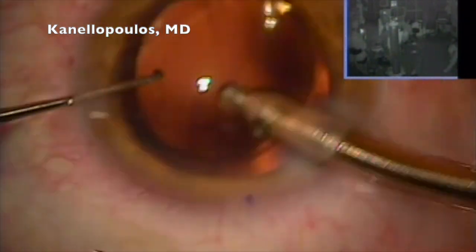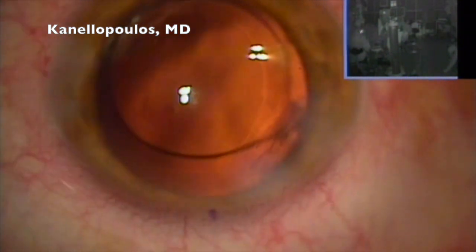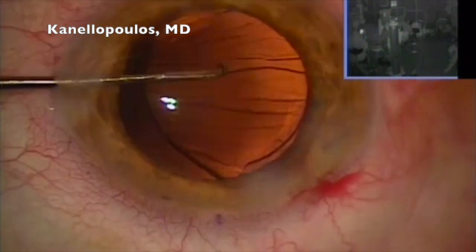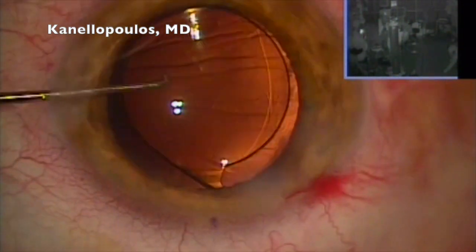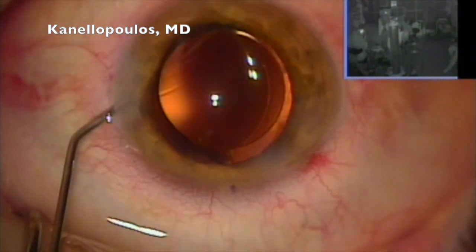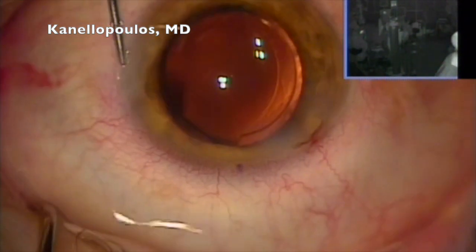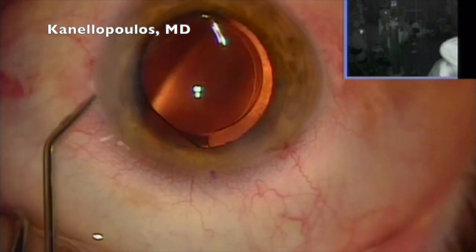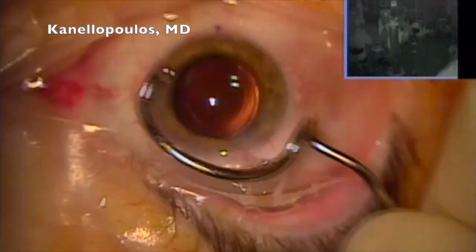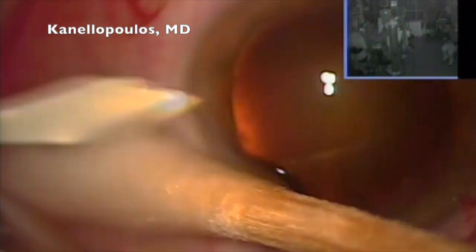Another uneventful case. A little blemish here behind the lens. I want to make sure it's out, hydrating the incisions. Again, patients need not to rub their eyes the day of the surgery, and 5 days on topical ofloxacin and an antibiotic dexamethasone combination drop. Very careful to make sure my incisions are watertight. Again, very meticulous in the axis of the toric lens and make sure that the lens is captured by the bag. Patient is done. We're going into the next patient, a little older.